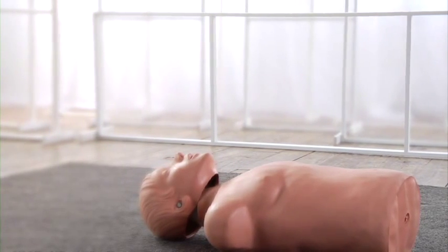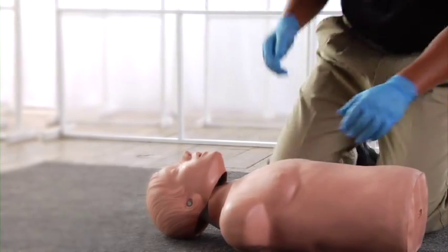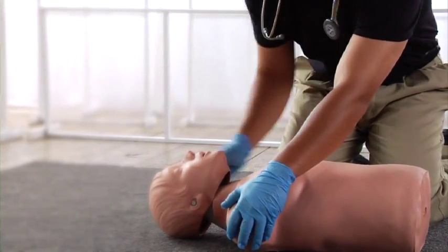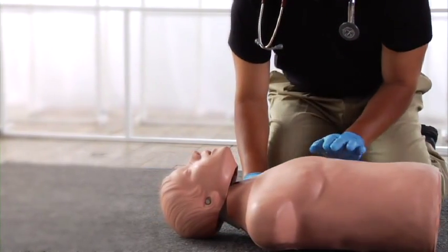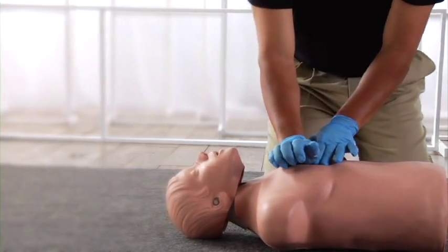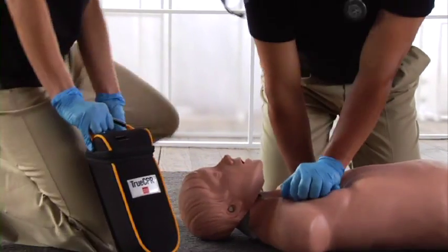You have an unresponsive patient. Verify the patient is not breathing normally and has no other signs of circulation. If there are two rescuers, one should start CPR while the other prepares the device. If your patient is on a mattress, place a backboard beneath the patient according to standard protocols, then insert TrueCPR between the patient and backboard.